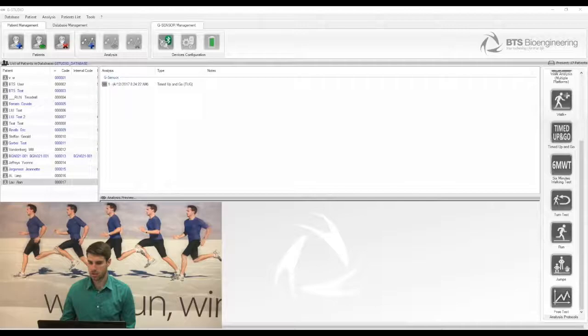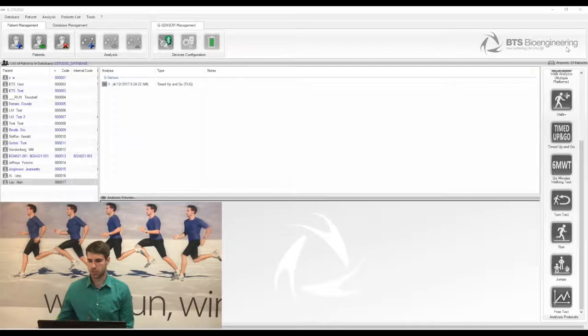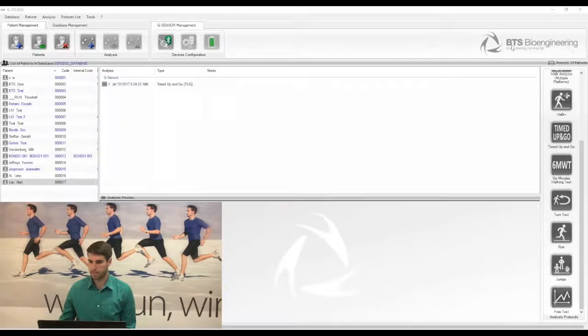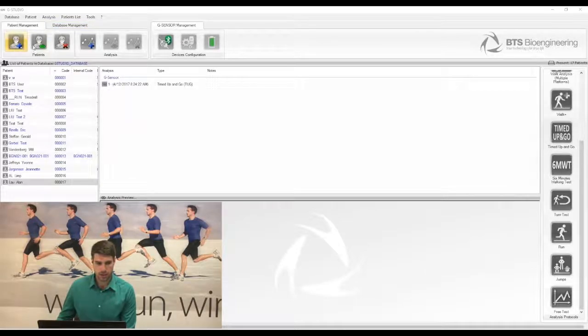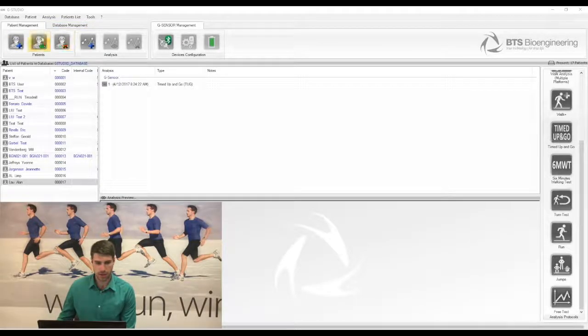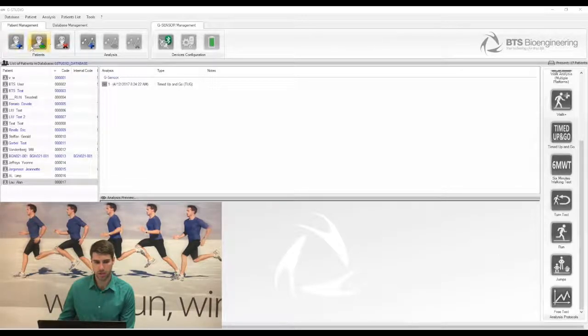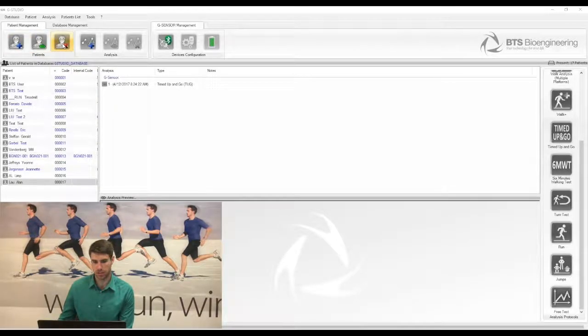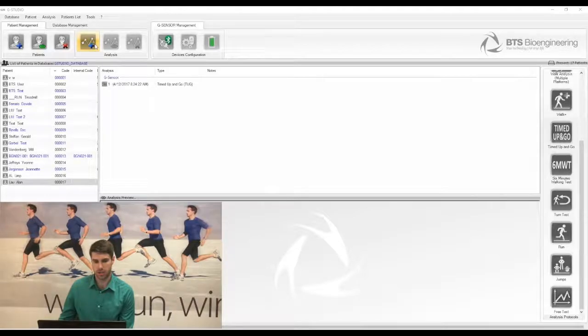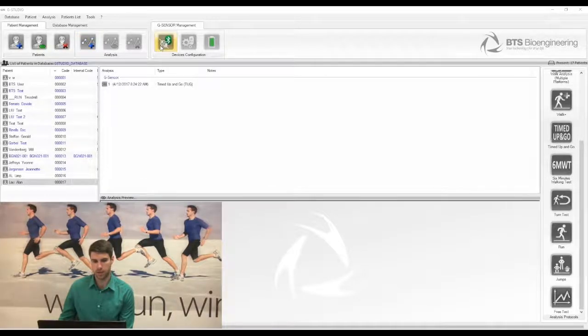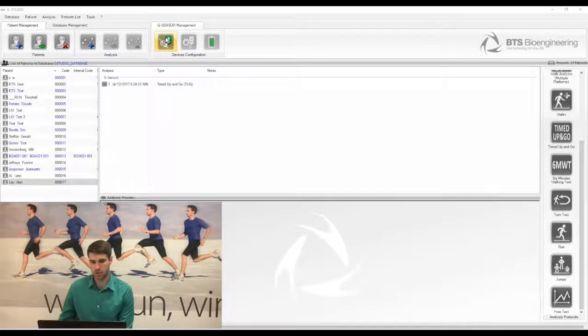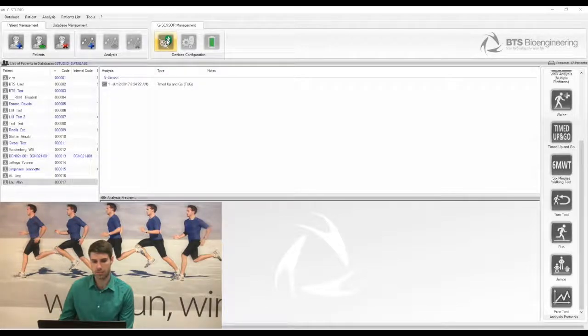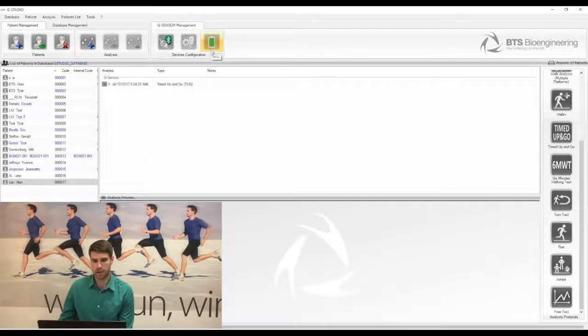So let's start by taking a look at the acquisition software for the G-WALK, which is called G-Studio. As you can see, in the top left there are three icons that manage your patient database. You can add a new patient, edit a patient, or delete a patient. This next button allows you to add a new analysis for an existing patient, and then the three buttons on the right side manage your sensor, so it allows you to connect or disconnect the Bluetooth connection and then see the battery level of the sensor.